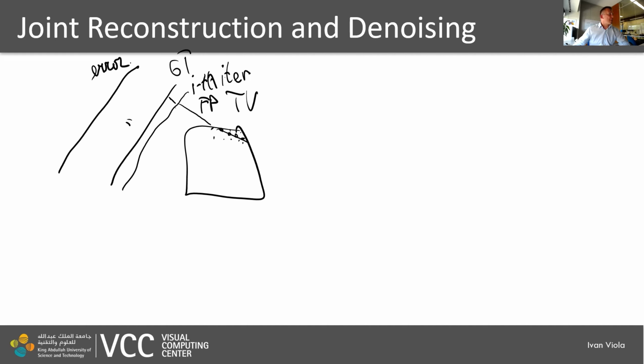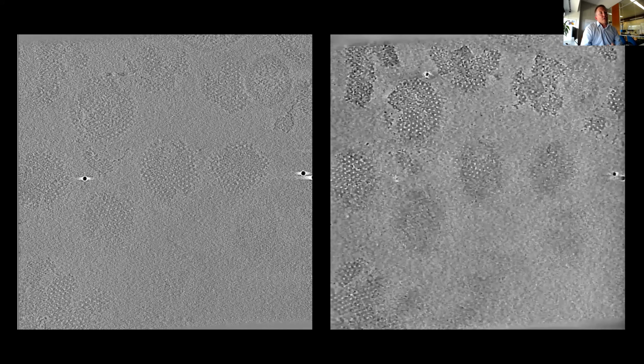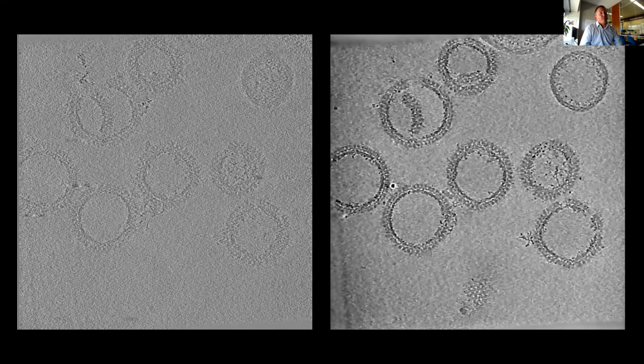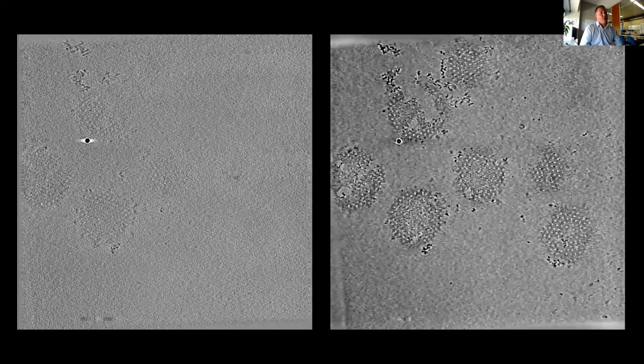Please note that as it is part of the tomographic reconstruction process, we always have control over how far we go from the original projection. We do not have this information available if we perform the smoothing on the already reconstructed volume, or if we do it uncontrollably on the projection first.